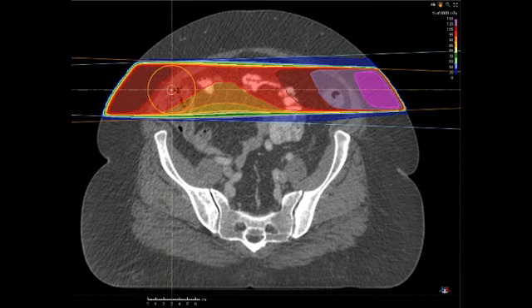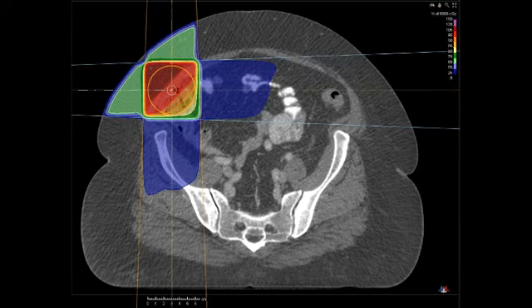And here's what the dose would look like. This would not be a very good approach because you would get a very high hotspot in the left region of the patient. So you could consider another approach. Let's take a beam from the right and then a beam from the AP direction and combine them like this. And here's what you get. And this is closer, dose to surrounding tissue is lower, but the dose is not very homogeneous in the tumor.